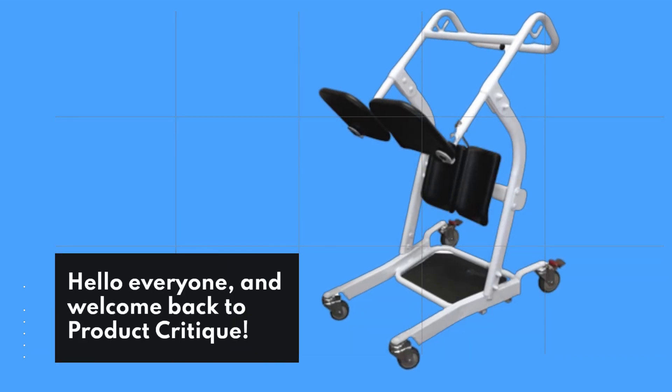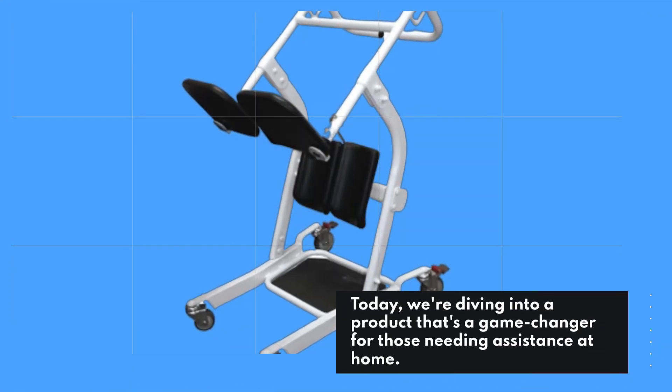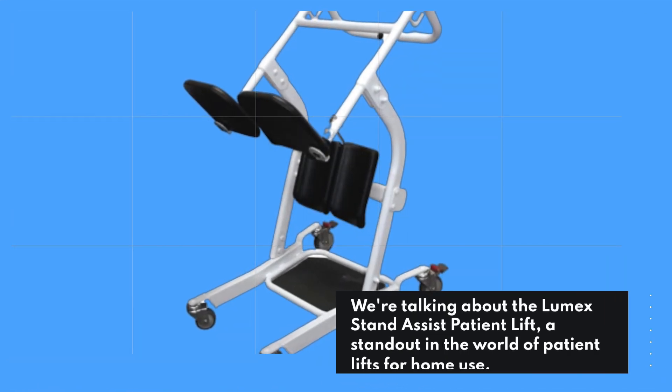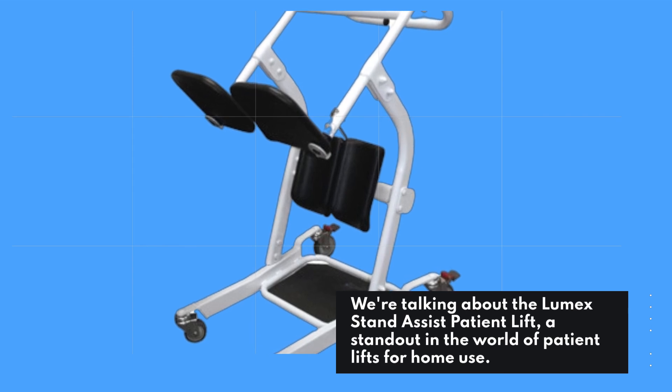Hello everyone, and welcome back to Product Critique. Today, we're diving into a product that's a game-changer for those needing assistance at home. We're talking about the Lumex Stand Assist Patient Lift, a standout in the world of patient lifts for home use.